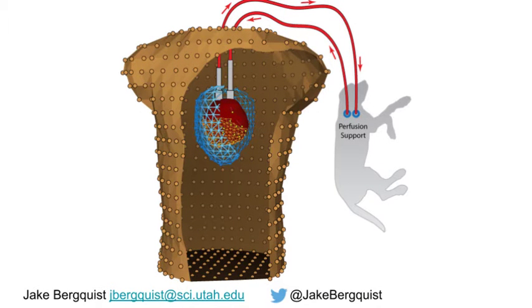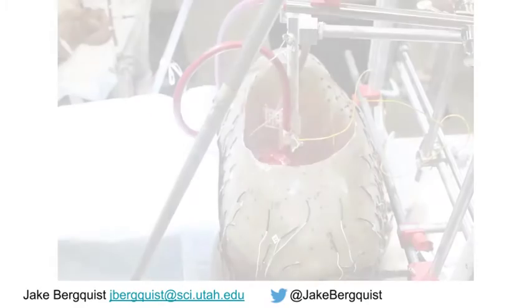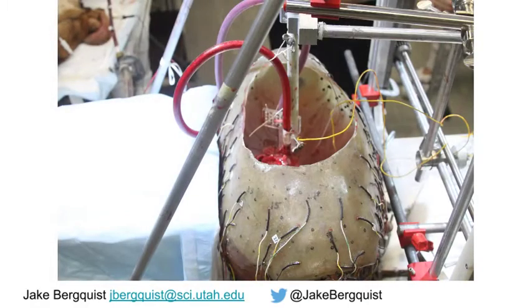To address this need, we have developed a unique experimental setup with several sources of error in mind. To control for conductivity, we have developed a Langendorff torso tank experimental preparation. The torso tank is filled with a conductive medium that has a known conductivity, removing any errors associated with inaccurate measurement or assumption of conductivity values in an inhomogeneous torso.